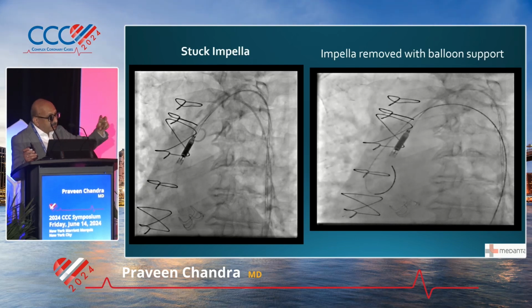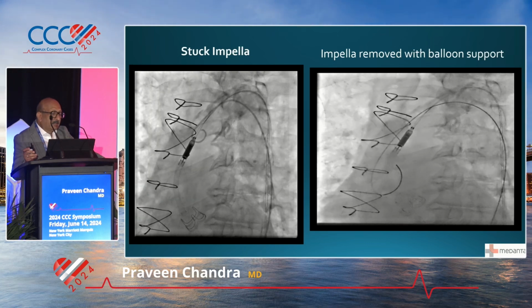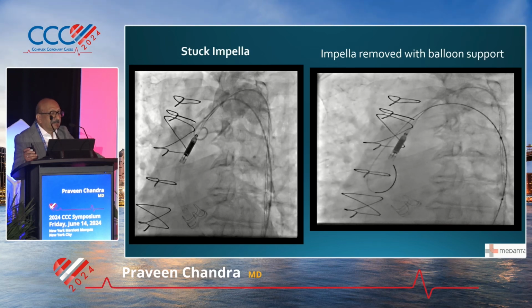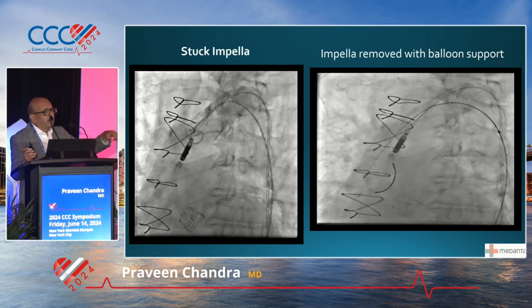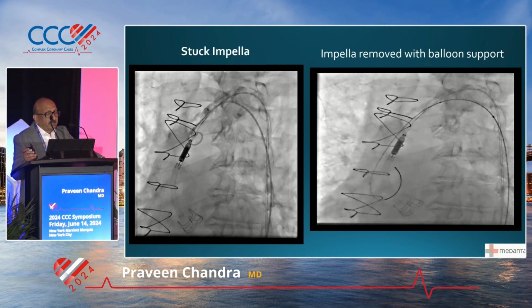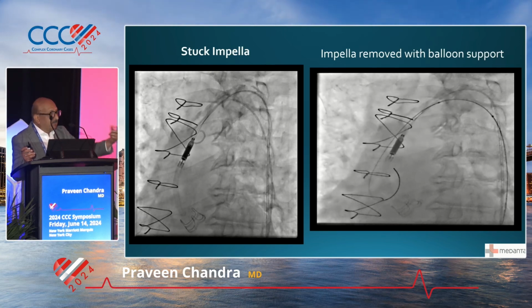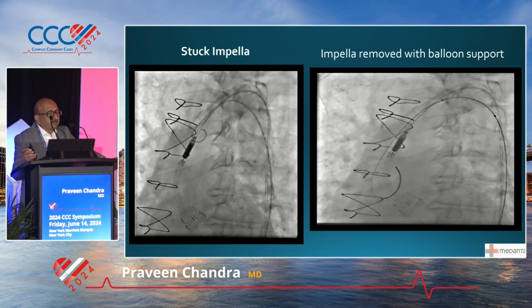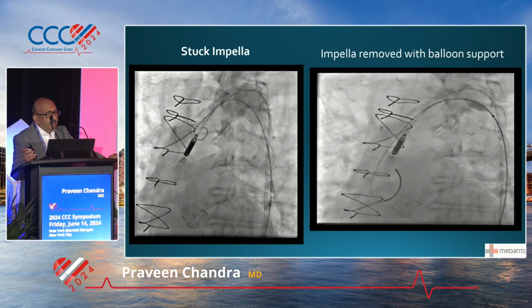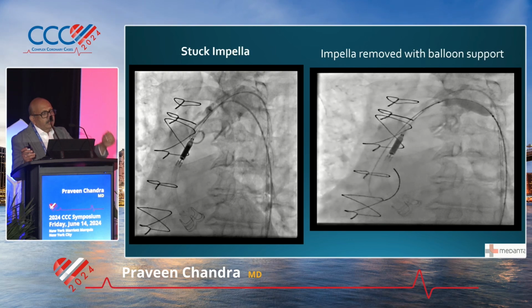Initially we thought that probably the Impella is getting stuck at the bioprosthetic valve. But we didn't find that, because it did come out a little bit, and then it was not coming out. You can see that the whole aorta is a porcelain aorta, and when we were pulling, everything is coming out. So at this stage we thought, let us do a check shoot from the same sheath, because there was no other access. We put the pigtail and checked that there was nothing obvious at the side except a heavy calcific chunk at the arch of the aorta.